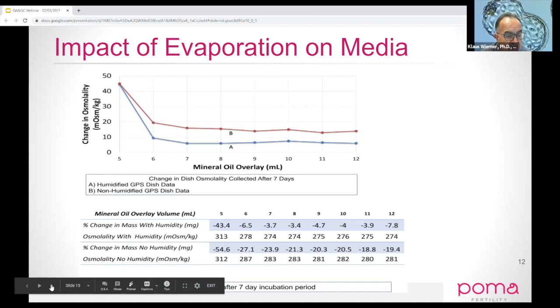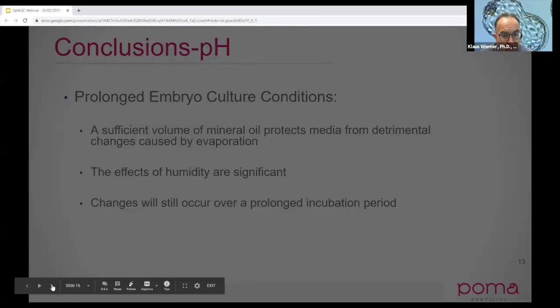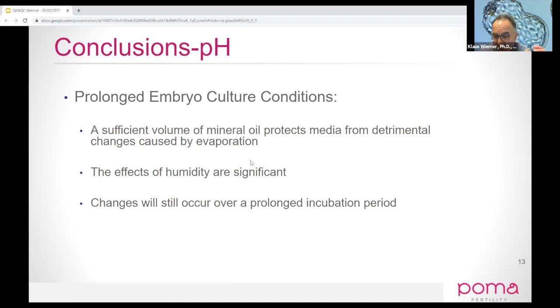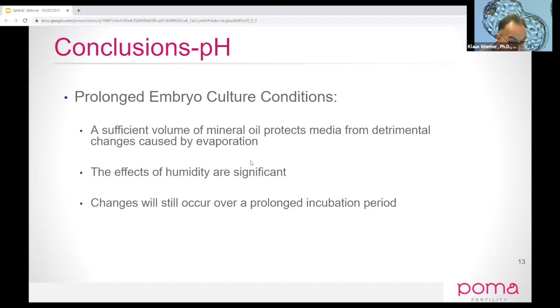Even in humidified incubators — in this data we were using planar incubators — we still had quite a bit of evaporation. In conclusion, we really have to have a sufficient amount of mineral oil to protect from pH changes caused by evaporation. The effects of humidity are great, and these changes occur over a prolonged period of time. I would suggest setting up mock dishes and weighing them at the beginning and say at the seventh day of culture, to get a pretty good idea of how much evaporation you're having in your culture system.